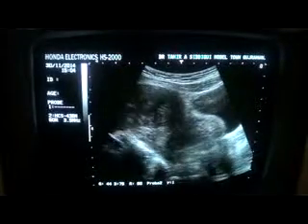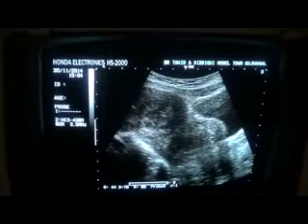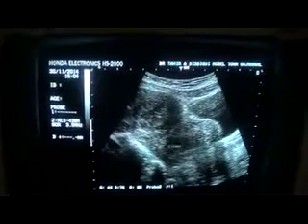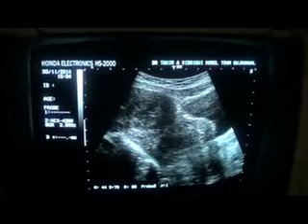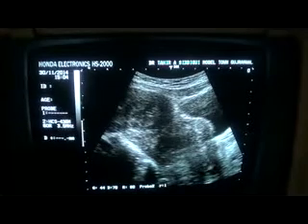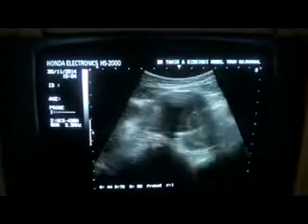Now in this segment I am trying to show you all the three together. Now this is the fibroid relating to the fundus of the uterus. This is the uterine segment that you can see. This is the endometrial canal. So this is the fundal region, pedunculated fibroid. This is the subserosal lower anterior wall, posterior segment fibroid, and this is the cervical fibroid. This is the vagina. So this was the longitudinal study; now in transverse section.